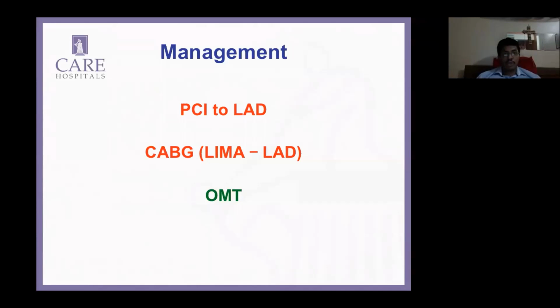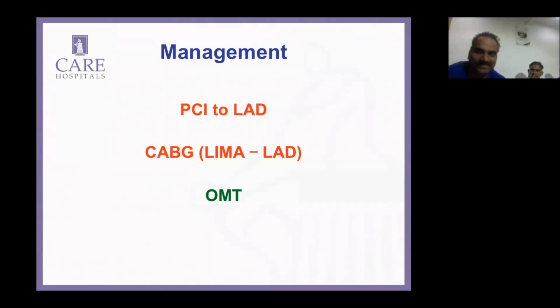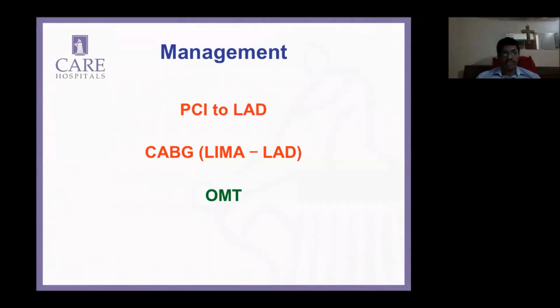Really, Sharat. So we have more surgical experience, and the surgeons don't want to tread into those areas where they're not able to see the vessel. Surgeons are increasingly using CT in patients like this in the city as well, wherein patients have had angios, complete occlusion, no clear retrograde filling. So I get a lot of requests for, John, have a look at the distal vessel.